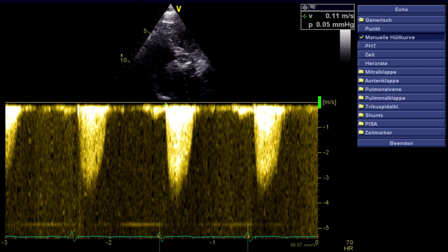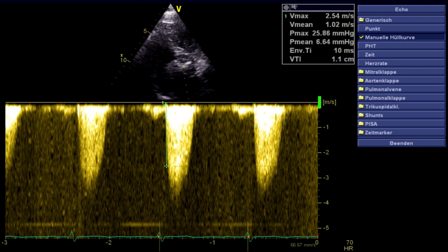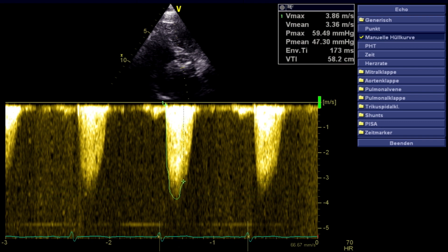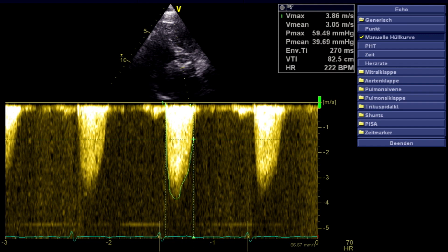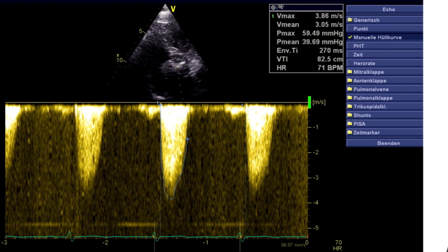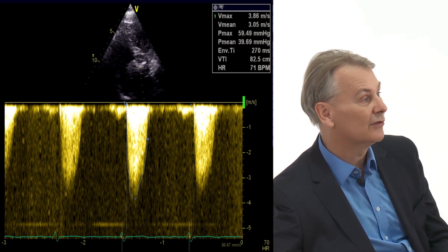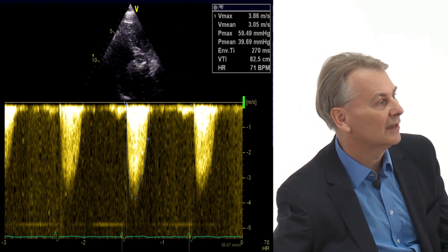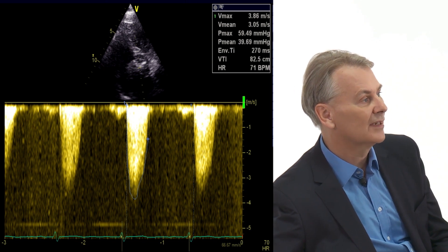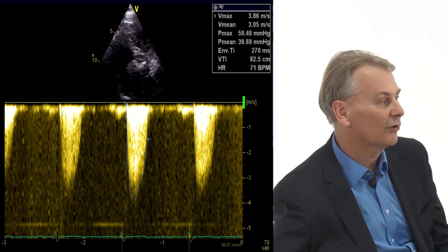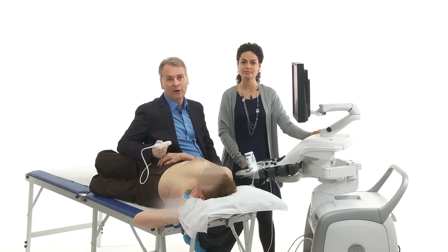At that time, you would not only get the mean gradient, but also the maximal gradient. We have a stenosis which is somewhere in the range of moderate to severe. The mean gradient is 40 millimeters of mercury, and the maximal gradient is somewhere in the range of almost 60 millimeters of mercury. So this certainly could be her problem.